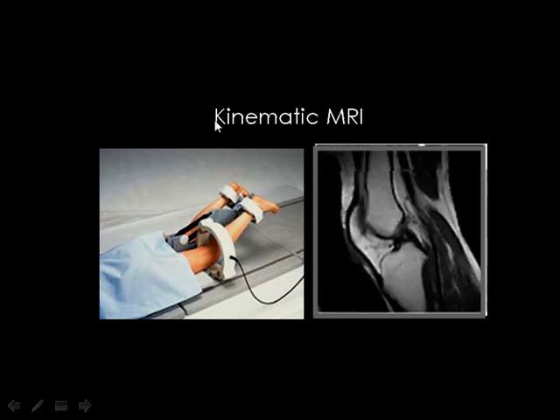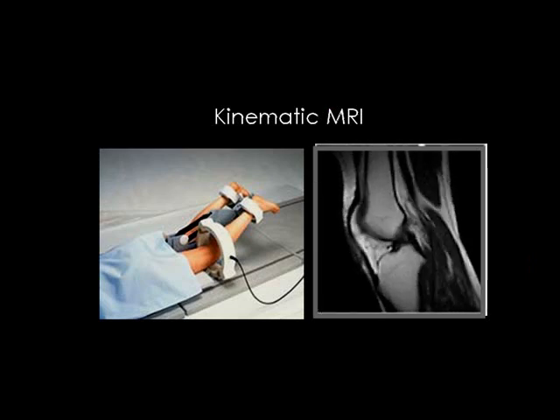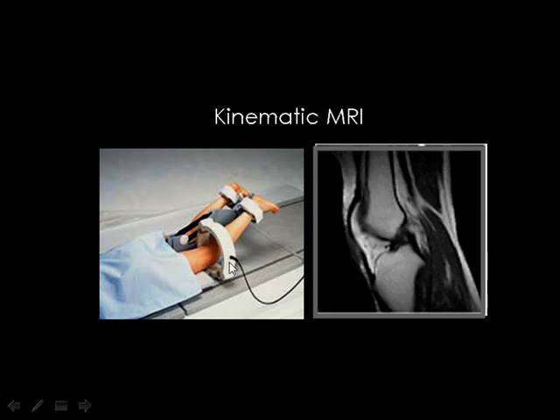And this examination is known as kinematic MRI. By kinematic MRI, we mean we examine the patient during motion. Then we are not able to examine the patient while walking. Then we simulate walking by putting this machine in between the patient's legs.